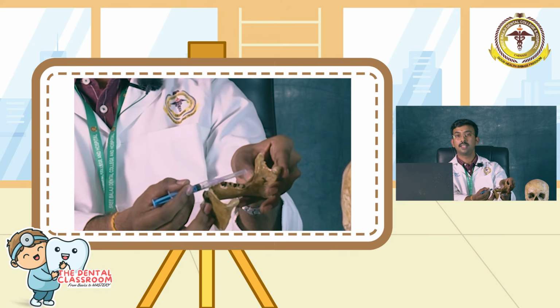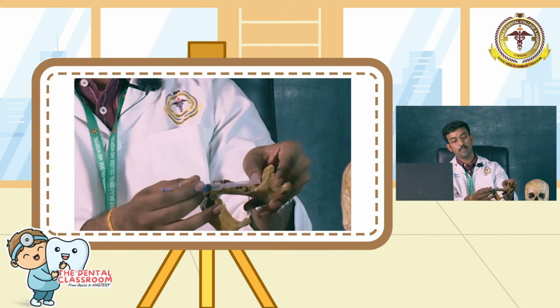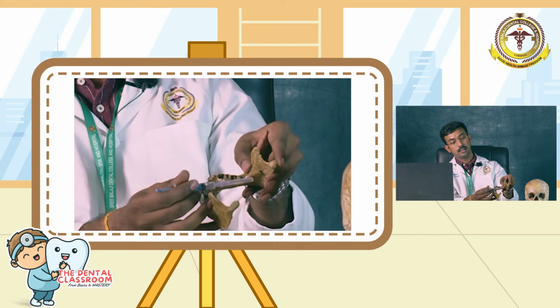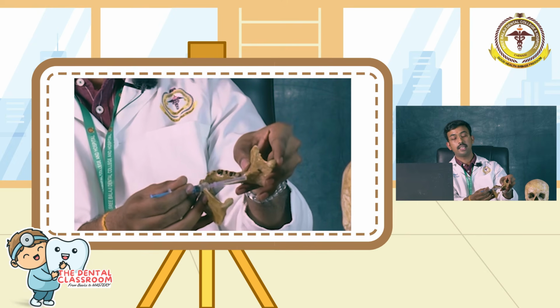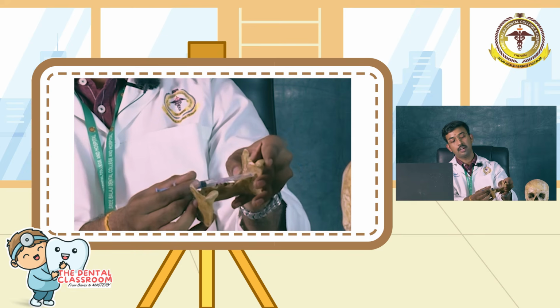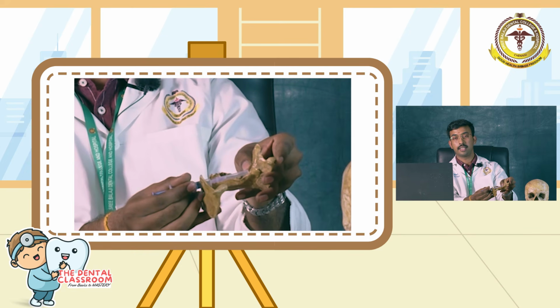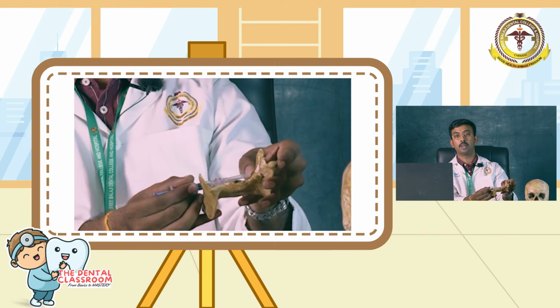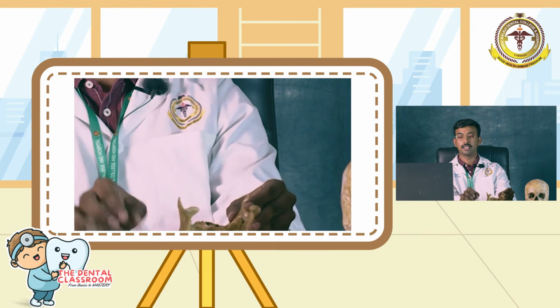Next, we are going to anesthetize our lingual nerve. The lingual nerve branch runs near the lingual cortex near your mandibular third molar. So, this is the area of interest where we are going to achieve lingual nerve anesthesia. After withdrawing halfway, we will aspirate again, and if it is negative, we will deposit about 0.2 to 0.3 ml of solution for achieving lingual nerve anesthesia.